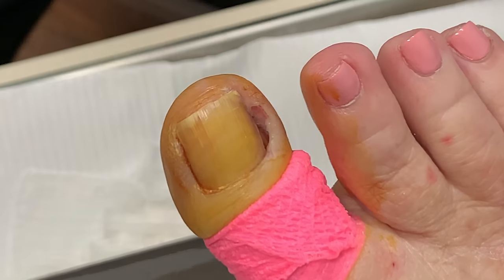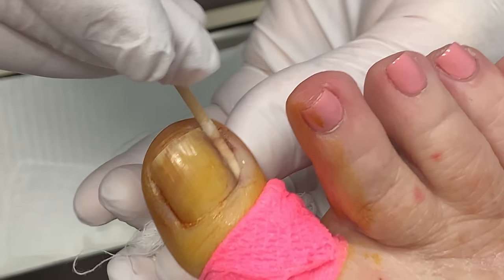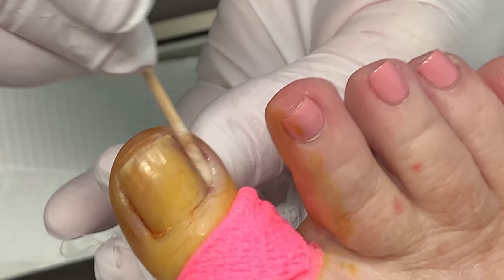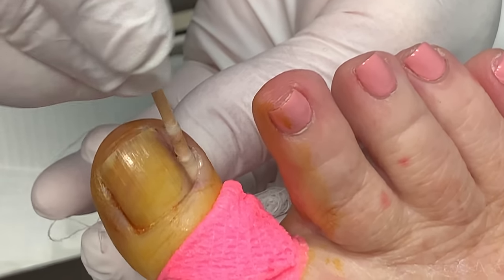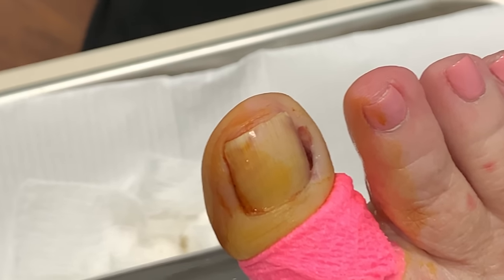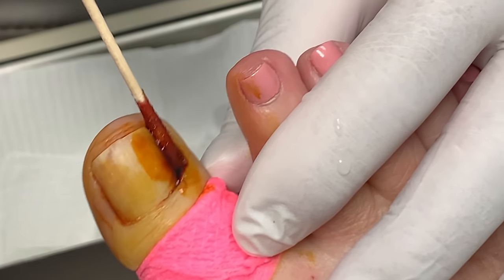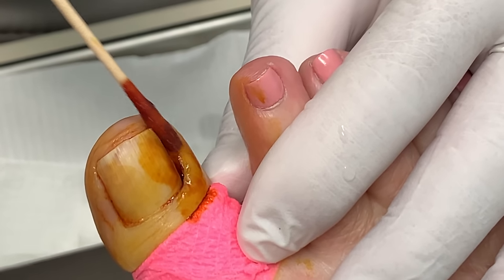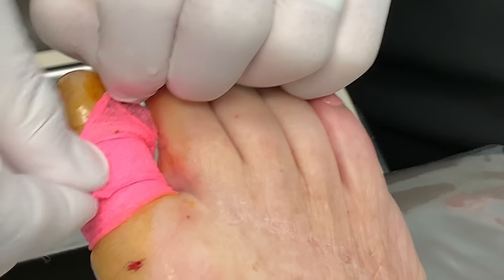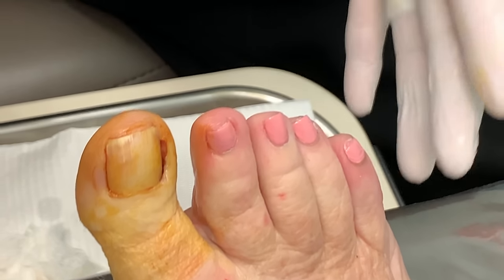We've got one more application down here. Let's get that drip out — we're going to flush it anyway. This is looking really good. I'm sure you're getting a great picture up there. It's pretty cool when you get a close-up — like a magnified view of it. So now we're going to put some betadine in there. That one's done. We're going to pick up the pace a little bit here. There's a lot of people waiting. That's it — looks good. And you can see there's very little bleeding in there, which is very cool. Now we're going to do the other side.